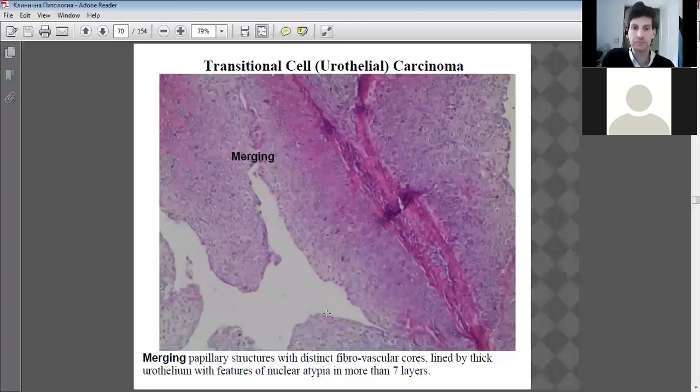Okay. He says quite correctly, nuclear atypia. Yes, so abnormal nuclear division, abnormal nucleolar shapes as well. The nuclei, some are round, some are elongated. A total abnormal cell division there. However, at the far right extreme, we have some normal nuclei, the round ones there. Those are more normal. Okay.